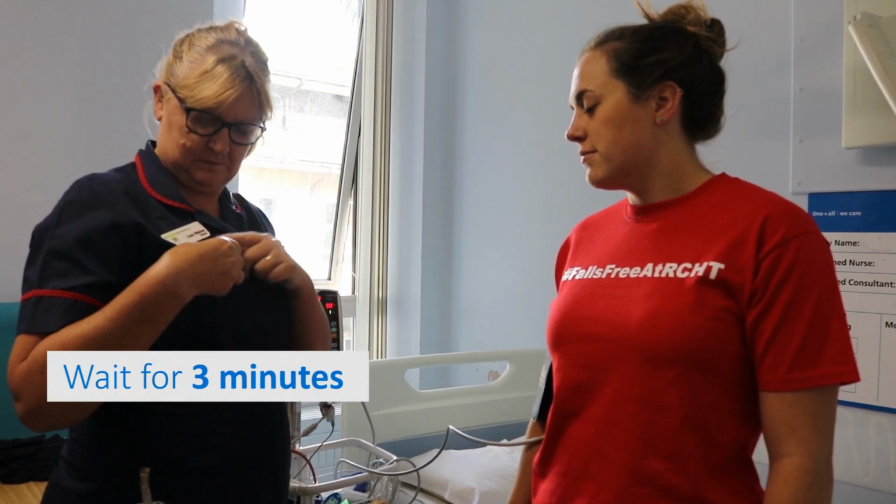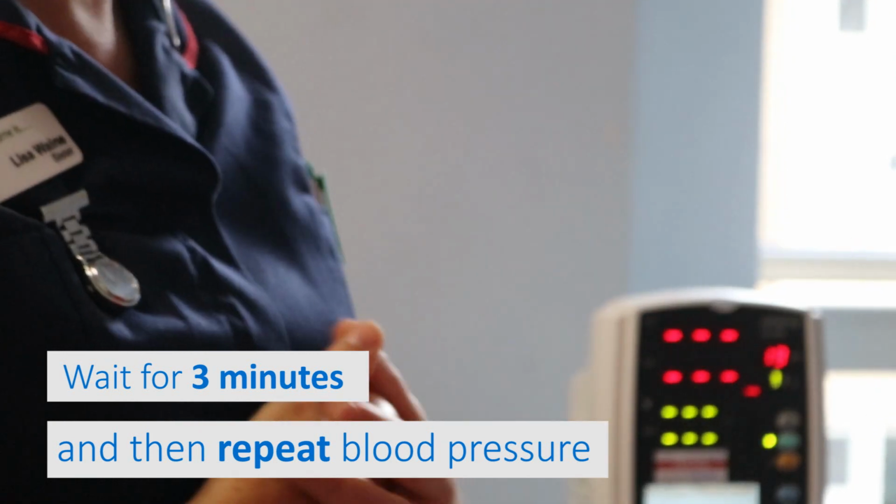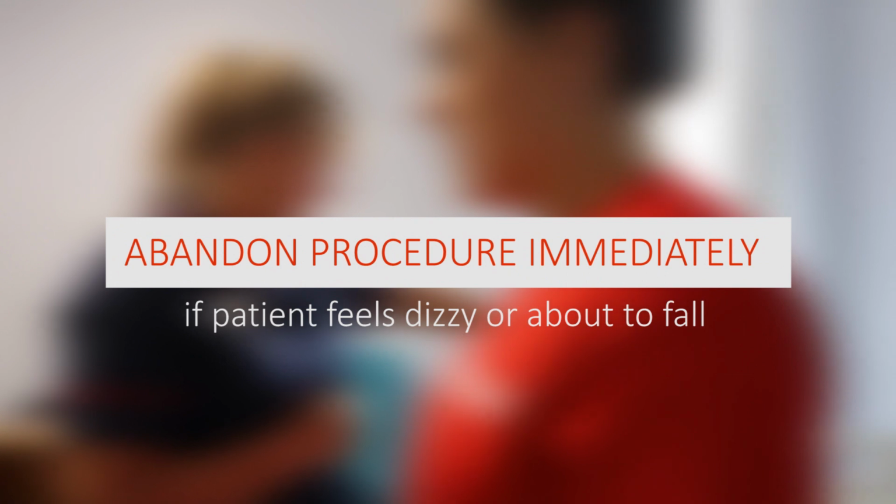Wait for at least 3 minutes. Repeat blood pressure. Abandon procedure immediately if patient feels dizzy or is about to fall.